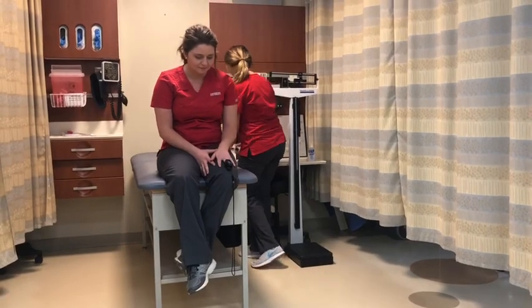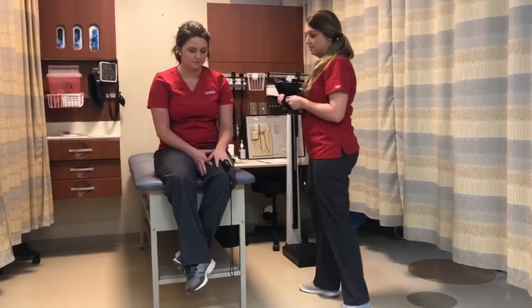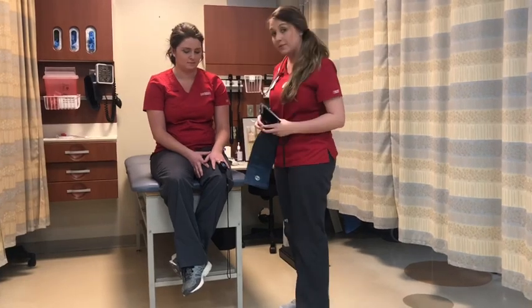Okay, and now I'm going to take your blood pressure. Patient's O2 is 96.